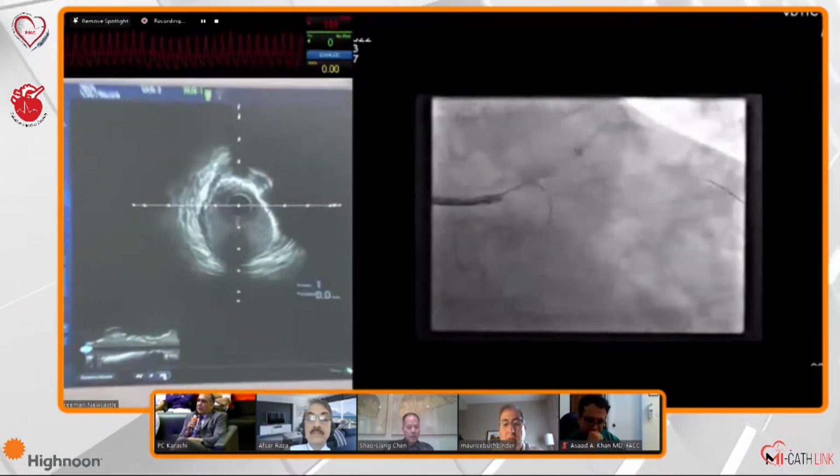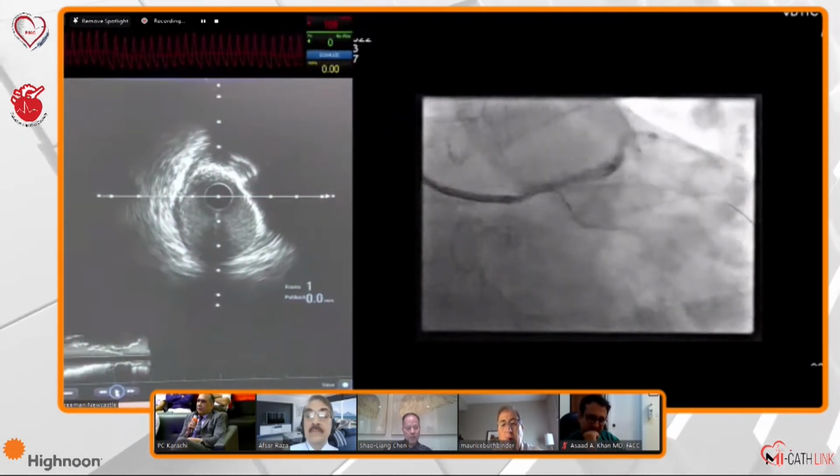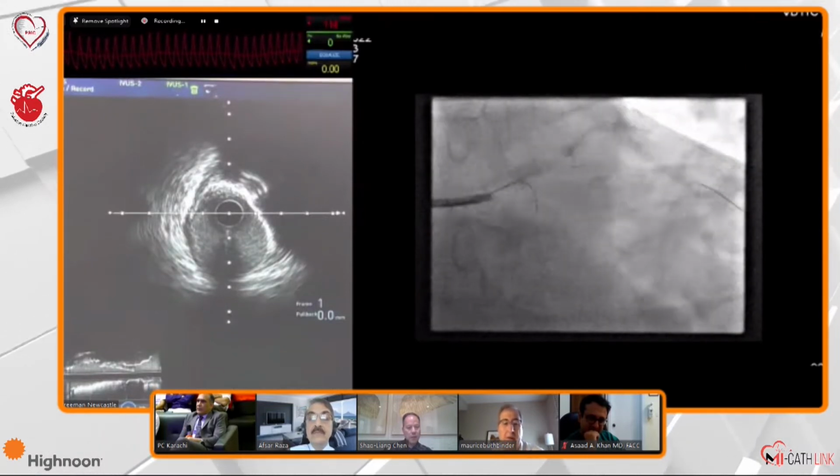You wired the 3 wires just for the IVUS. This is for the IVUS because we started a little early. I thought we'd do some work before. You don't want to be seeing me wiring the RT.